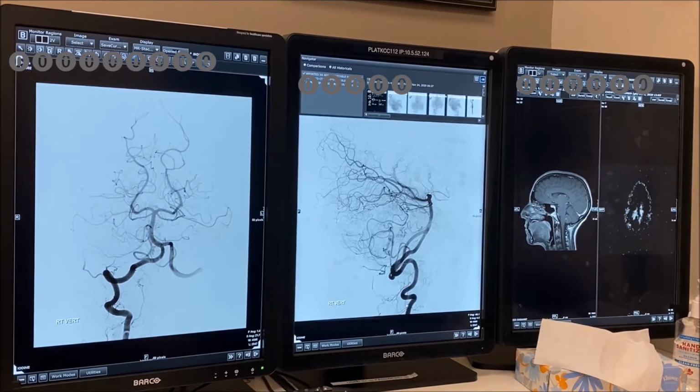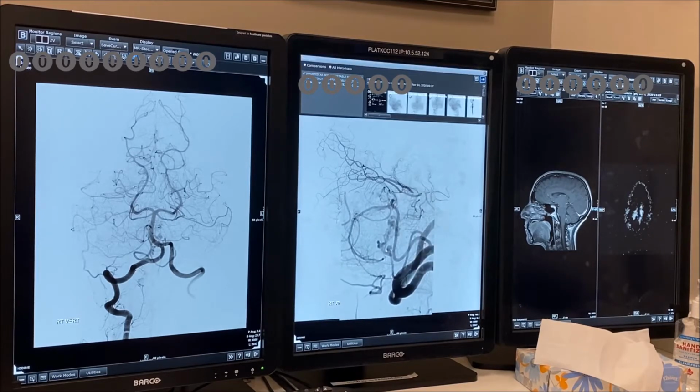This one also seems to follow, it will anastomose with the one on the other side. Yeah, the dens arcade, the odontoid process. It's got something here, I don't know exactly, but there is some schmutz there. Okay, but if we analyze this, what would you call this? Let's take one at a time. What do you call this thing? That looks to be a saccular aneurysm.